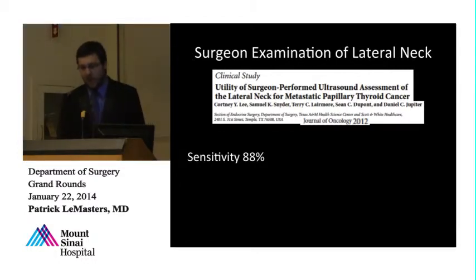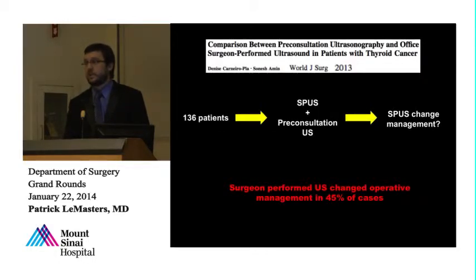So how good are we at diagnosing thyroid cancer, and how good is the surgeon-performed ultrasound as compared to a pre-consultation ultrasound? This is a recent study out of the Medical University of South Carolina. They looked at 136 consecutive patients. They had surgeon-performed ultrasound and a pre-consultation ultrasound by a radiologist. And they looked at whether the surgeon-performed ultrasound changed management.